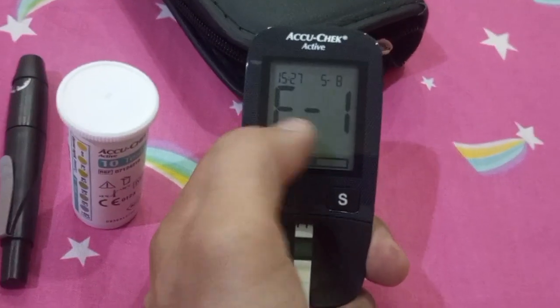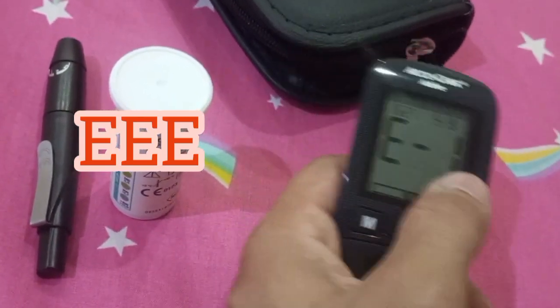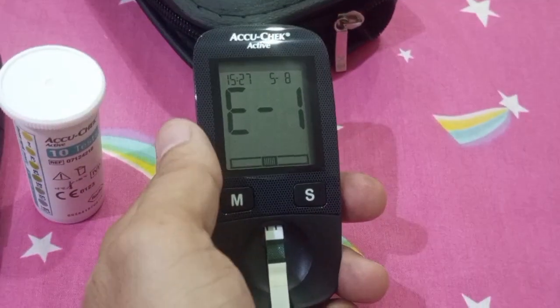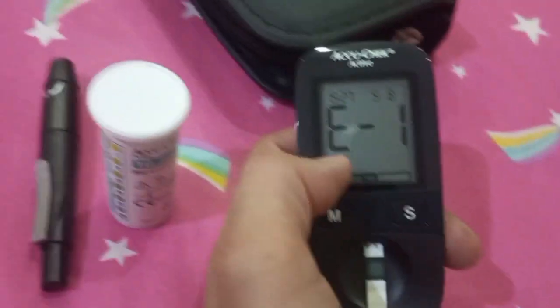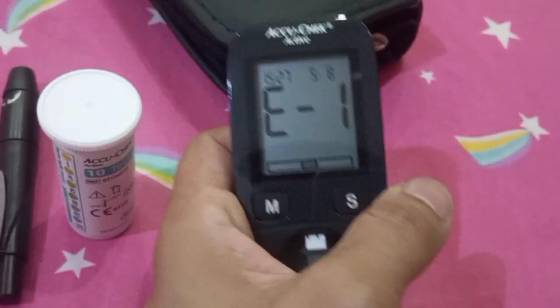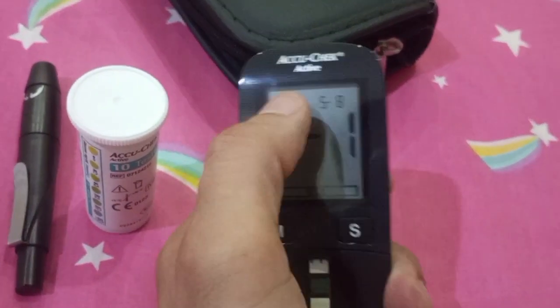If the glucometer gives an EEE error, it simply means the glucometer is having some issue with its circuitry and you need to contact support. You may try repeating the test with newer strips, but if it continues to give the EEE error, there is clearly an issue with the glucometer itself.